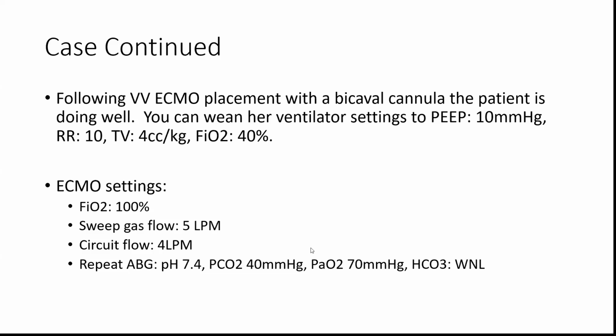Okay, so it's a little bit high. So you think we could probably come down on the flow a little bit for this patient? So the FiO2 on the circuit doesn't affect the oxygenation as much. When we're talking about the oxygenation, flow is going to affect the oxygenation, and then sweep gas flow is going to affect the CO2. But I agree with you. I think we could probably come down on the flow with this patient. That may be a change that we can make.